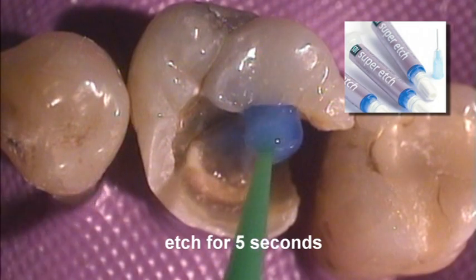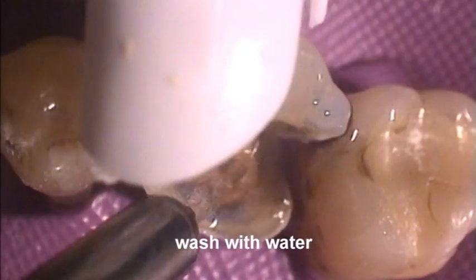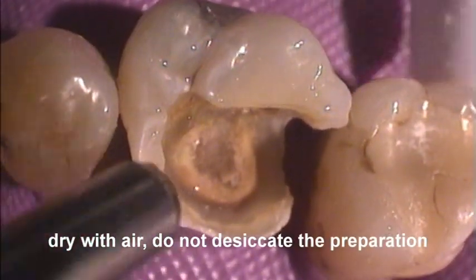Apply Super Etch 37% Phosphoric Acid for five seconds and wash away with copious amounts of water. Dry but do not desiccate the preparation.